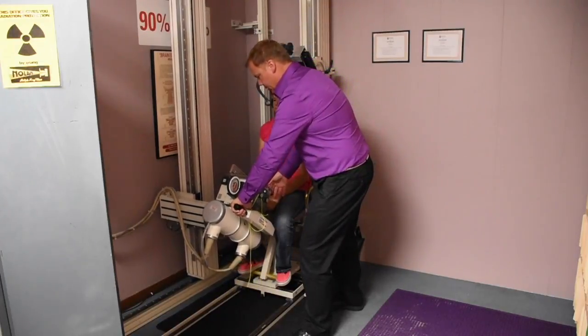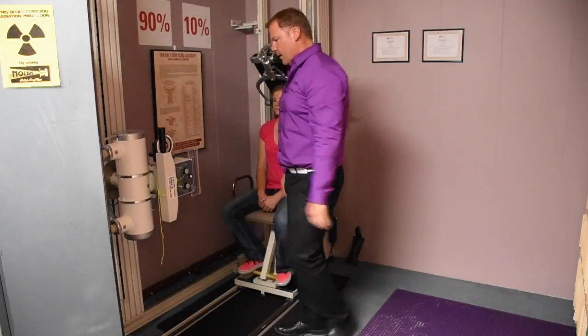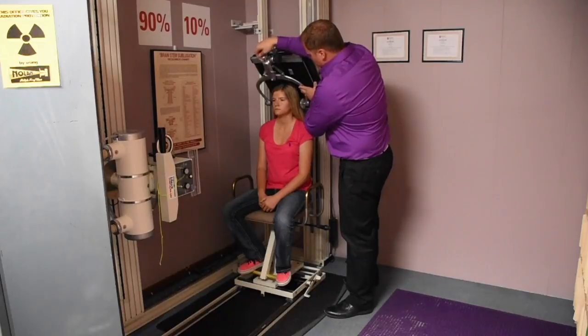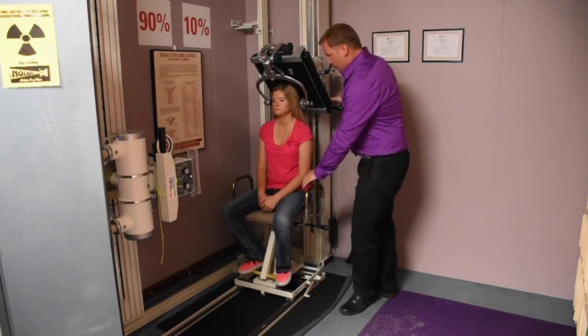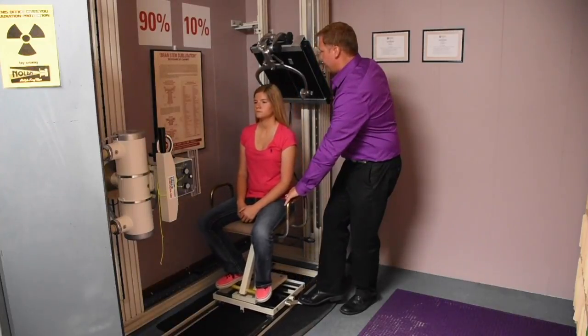Depress the button and move this back and away so we've got a safe distance. Then loosen the head clamps up just like that, move this up slightly, and move the patient out at the same time.